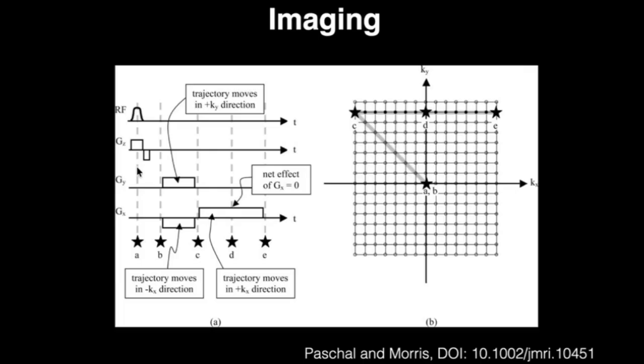Now that you have your tissue in that particular region excited and ready for imaging, the rest, in the XY plane, represents where you spatially encode that information so that you can get localization information from different parts of the tissues in your sample.